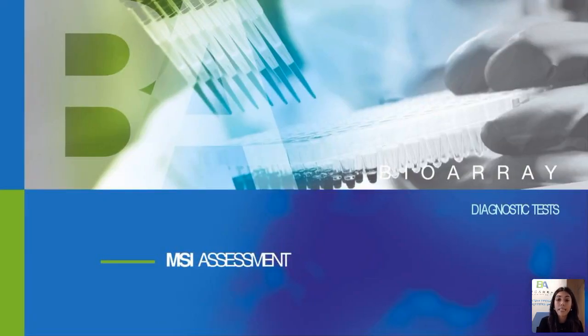So the next one is the microsatellite instability assessment test. We have decided to dedicate one test to this because microsatellite instability has, in this last year, proved to be a really well-defined marker to consider immunotherapy. Patients with high microsatellite instability are patients that end up responding really well to immunotherapy.